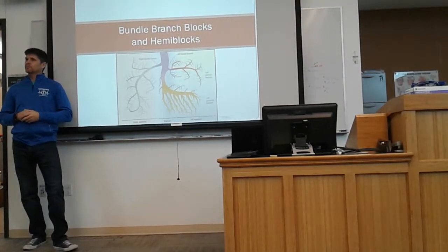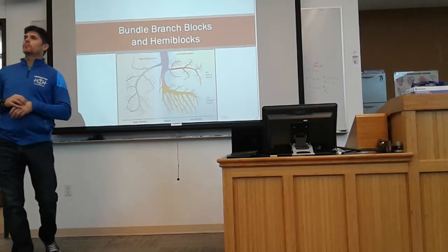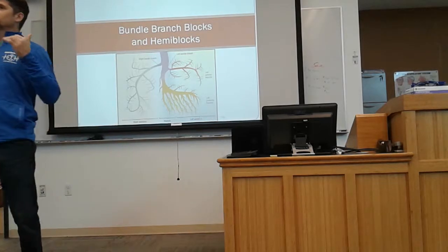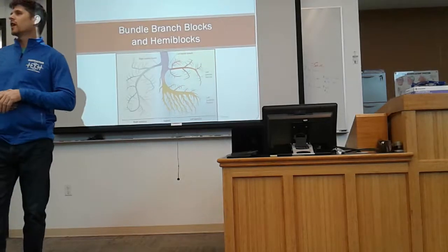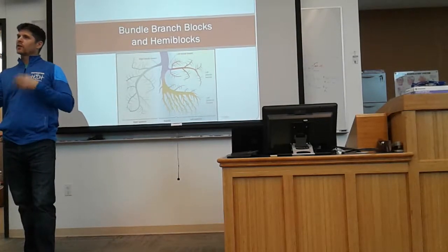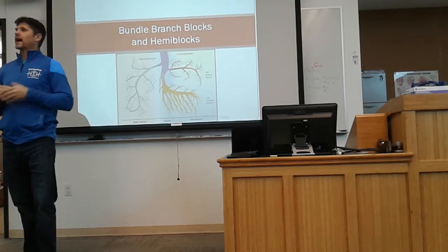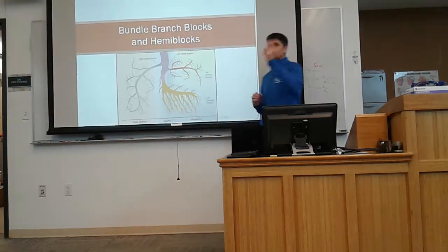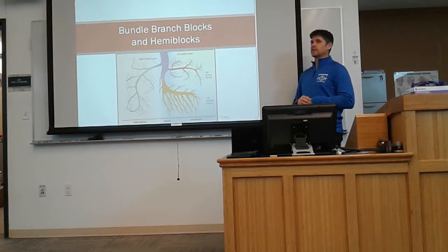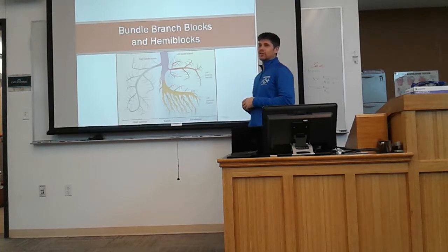Is that important information to know? It'll become important information for you to know while you're determining where the block actually is. But whether or not the QRS complex looks one way or the other in and of itself doesn't matter, other than being able to tell where it's at. Does that make sense? Good. You will be able to tell very easily where these are at, based on what you see in particular leads. You need to look in particular leads on this.